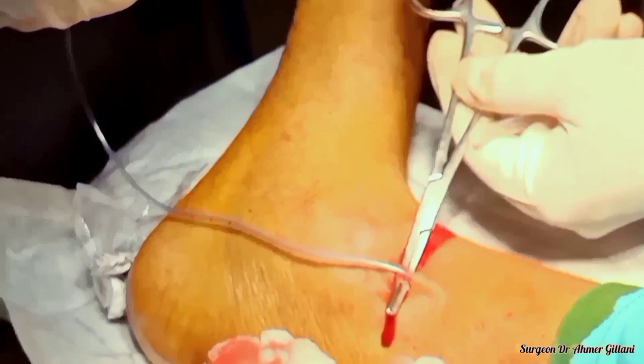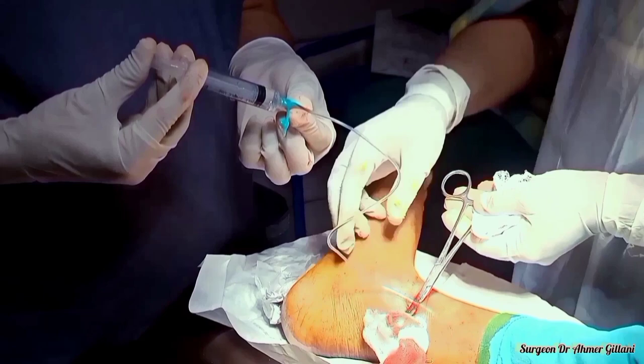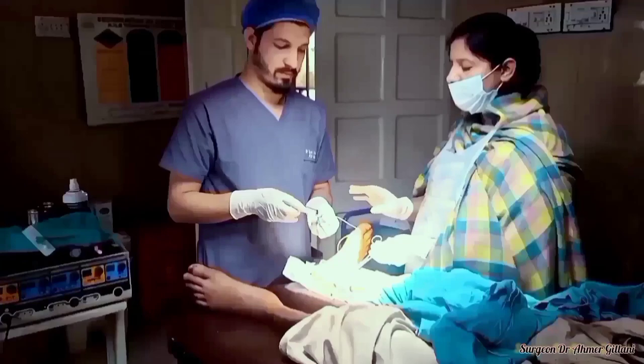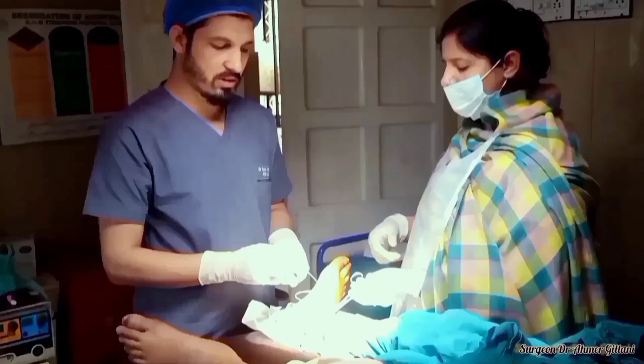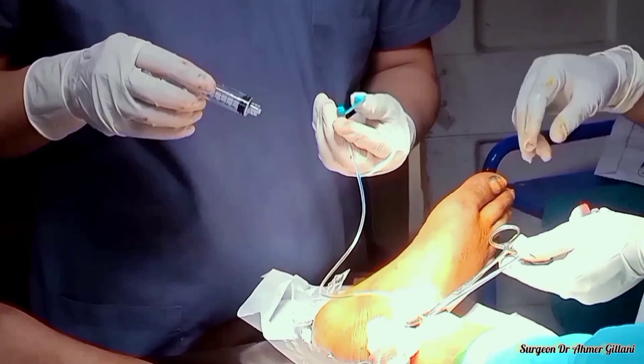We have put the number six NG tube into the vein and our venous access is complete. We are checking with the help of a syringe the patency of our track — alhamdulillah, it's successfully going in. Finally, our main procedure is completed.